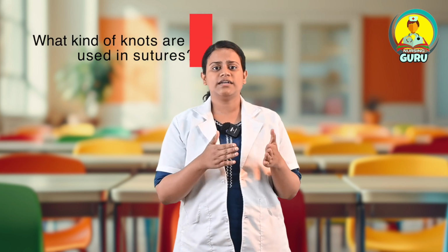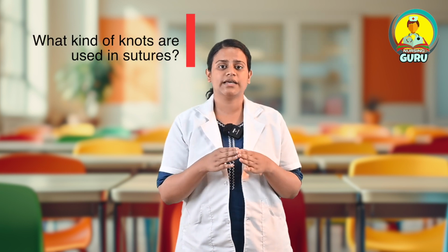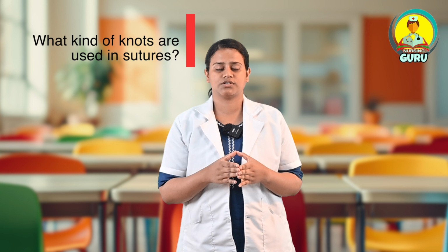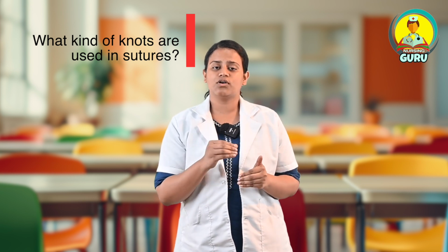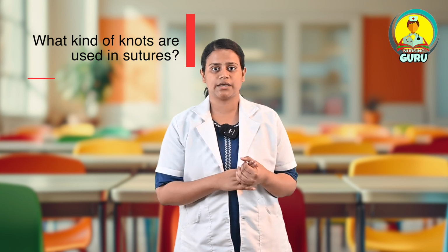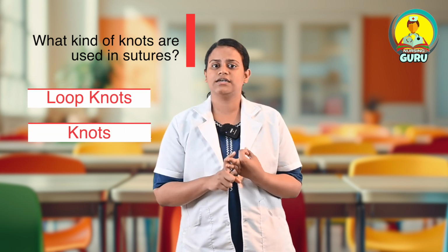Till now we discussed the suture and its material. Now we also have to know the knots which are used in sutures, how they are done, or what kind of knots are being done. There are different types of knots, and different techniques to do these knots. These are known as surgical knots. These knots are divided into three different parts: one is loop, one is knots, third one is ears.